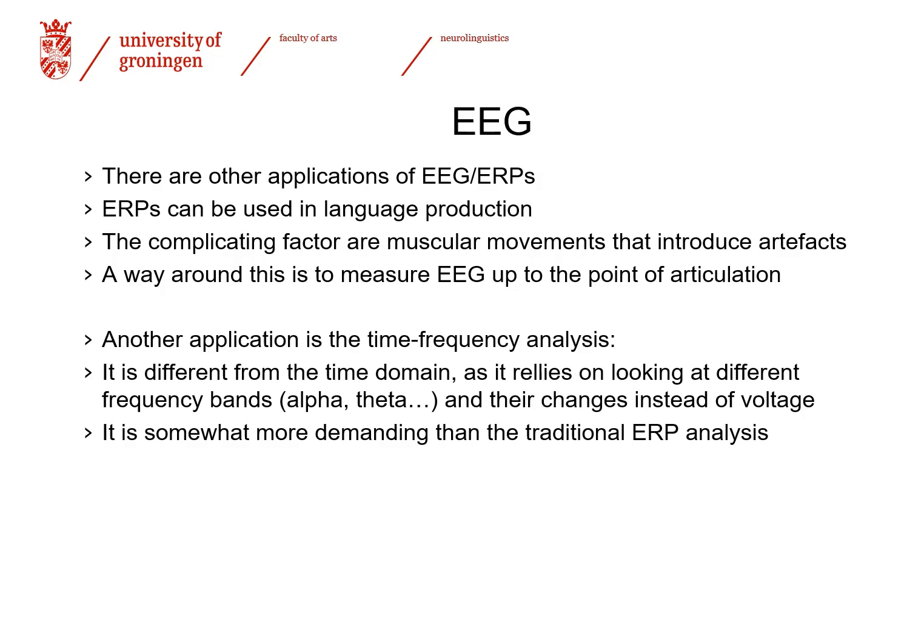So, for example, we can record only up to the point of the onset of speech production so as to avoid these artifacts. But in order to be able to do that, we need to do quite a few things, which makes the whole process much more technically and technologically challenging.